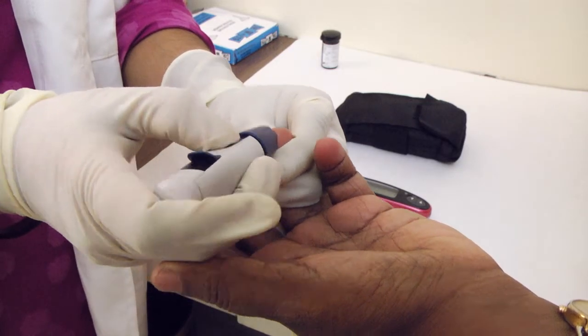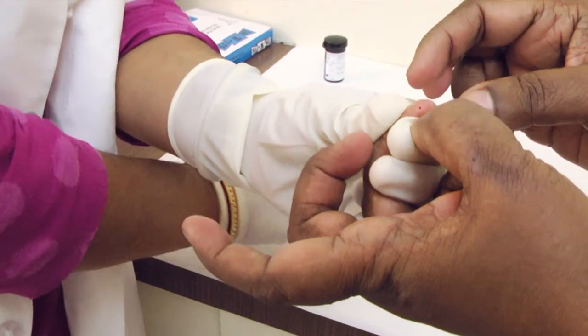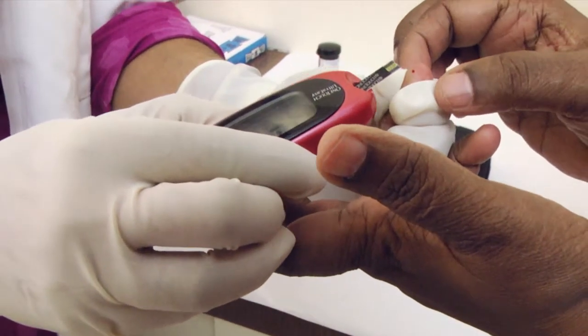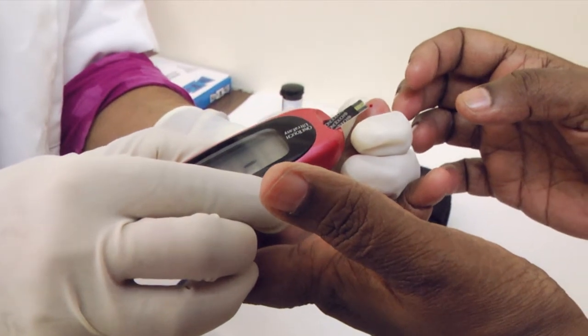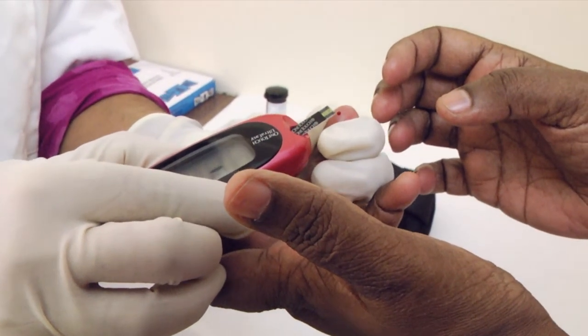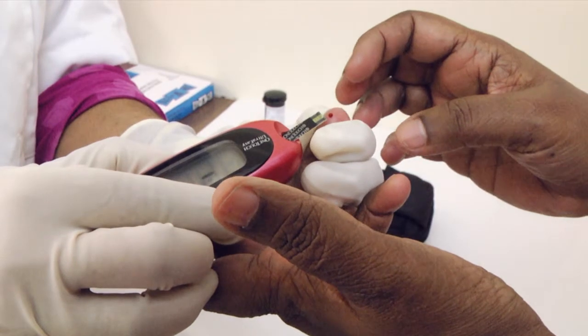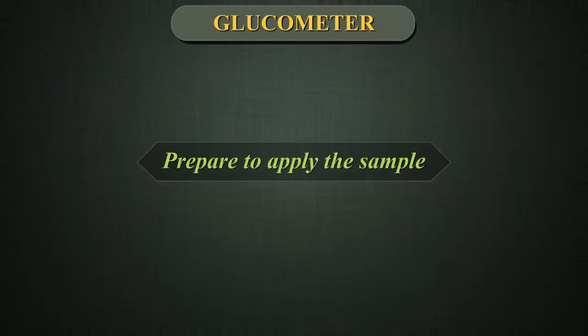Remove the lancing device from the finger. Gently squeeze or massage the fingertip until a round drop of blood forms on the fingertip. If the blood smears or runs, do not use that sample. Dry the area and gently squeeze another drop of blood, or puncture a new site.